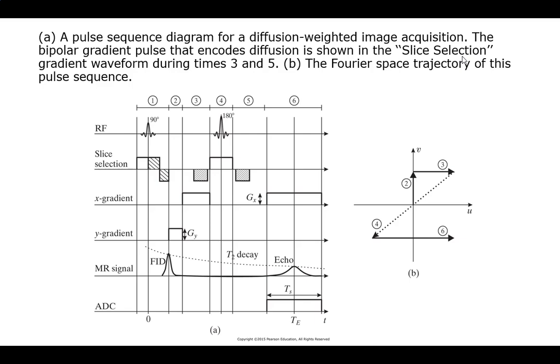Good? These are great questions. Now again, remember, the key thing in all of these is that these different ones are just perturbing the Larmor frequency. That was the equation we did on the very first day. That's why, like on the homework, she'll calculate the Larmor frequency. It's really a pretty trivial calculation, but everything is about perturbing that, because it's those frequencies that you're reading out of the k-space.